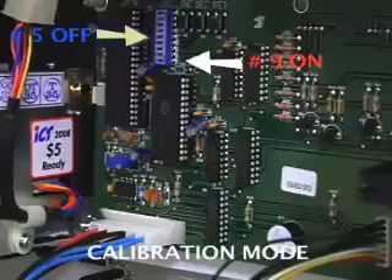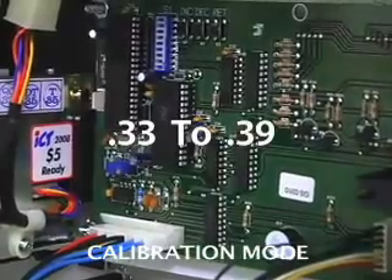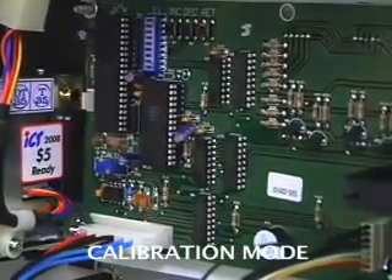The goal to calibrate the AlcoBuddy is to get the reading anywhere from 0.33 to 0.39. If we blow into the machine with the solution and it reads higher than 0.39 — for example, 0.51 — then we know that the solution reading is too high.